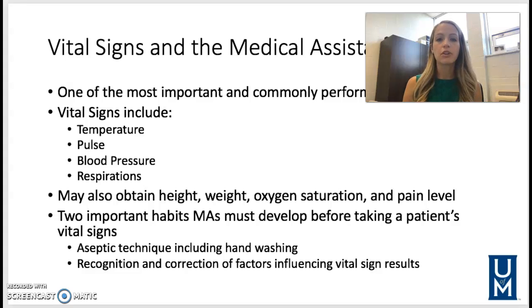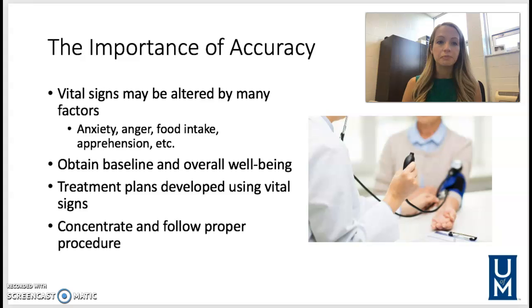So it's really important that we develop some habits in taking vital signs. One being aseptic technique. This includes things like hand washing and disinfecting the blood pressure cuff between patients. In our day and age, you can never be too careful with aseptic technique. Also, recognition and correction of factors influencing vital signs. On the next slide, we're going to talk a little bit more about that.